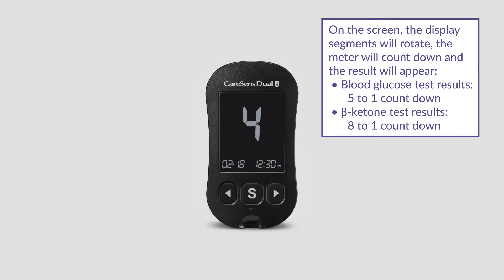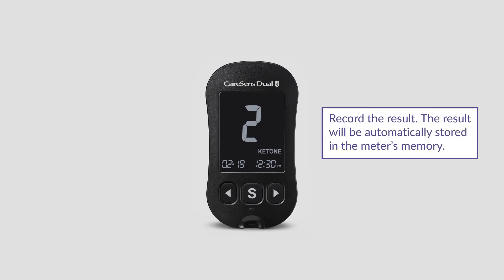For blood glucose test results, the meter will count down from 5 to 1. For blood beta ketone test results, the meter will count down from 8 to 1. Record the result. The result will be automatically stored in the meter's memory.